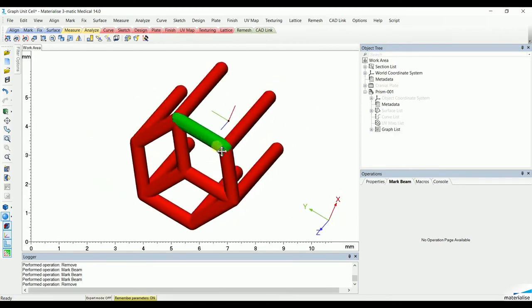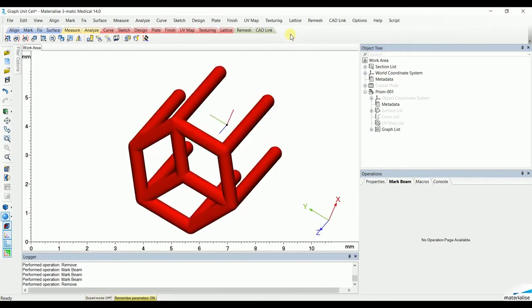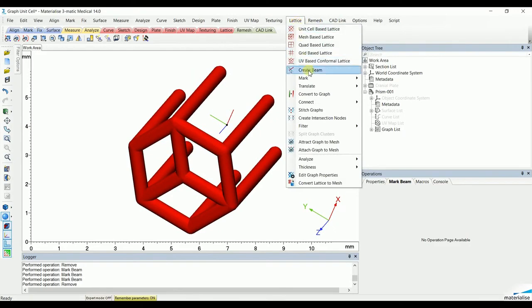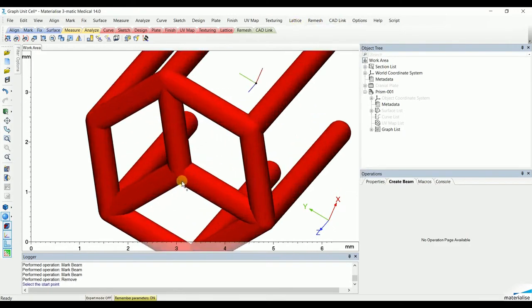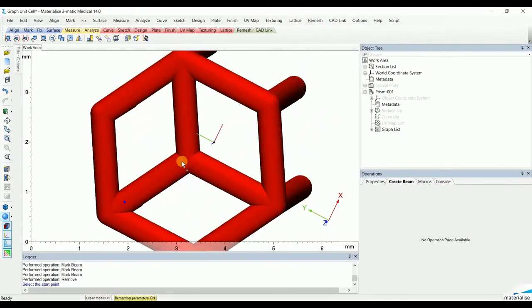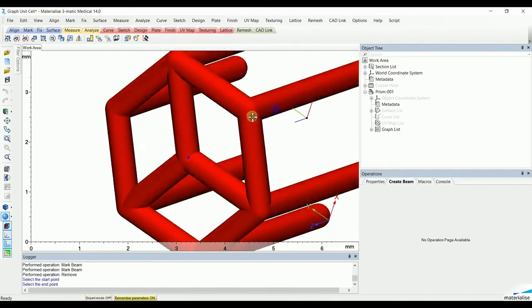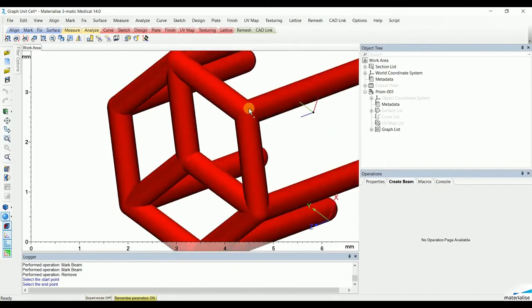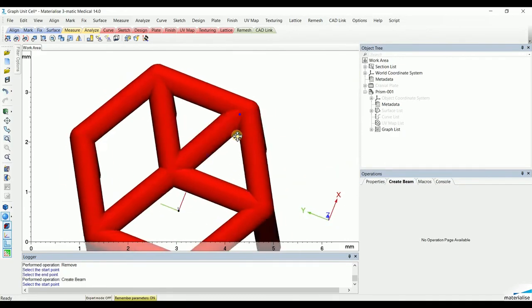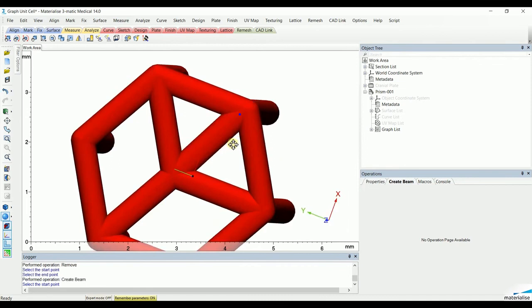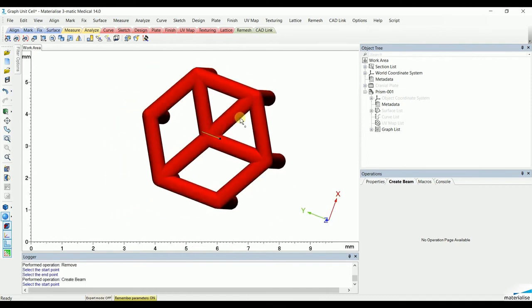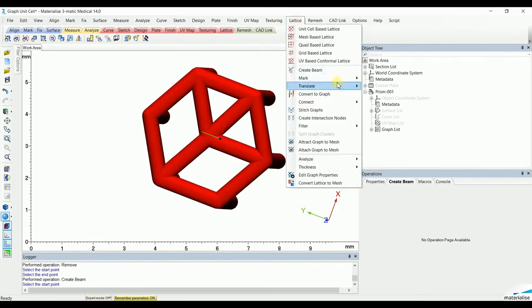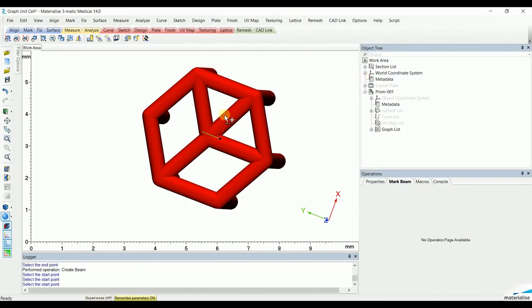Now, if we would like to add a beam, we can go to lattice create beam and simply select how we want to add the beam. If we would like to remove it again, simply go mark, mark beam, select the beam, and remove.